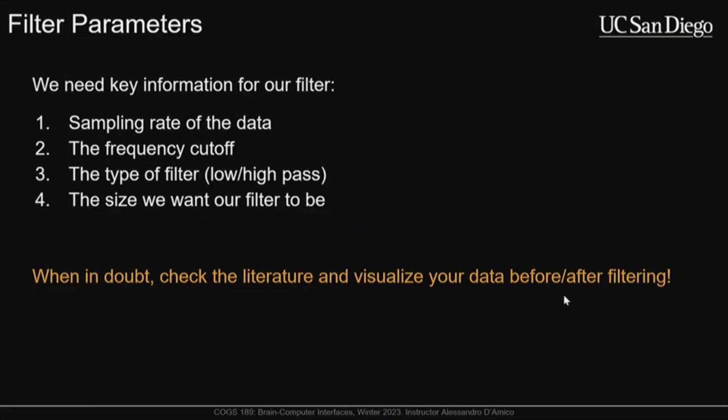Like maybe you wanted to do a low-pass filter, but you forgot to change the variable name, and it's doing a high-pass filter. You would instantaneously be able to tell that in your data. Or maybe you have a two-dimensional data set where you have channels in one dimension and time in the other dimension, and you accidentally filtered across channels rather than time. Again, you'll instantly be able to see that. These sound silly, but it happens. I have done that when I've been making things. I'm like, why is my stuff not working? And then I plot it, and I'm like, oh, I filtered across channels, not across time. So the simple solution: just plot your data. You'll easily be able to fix those problems.